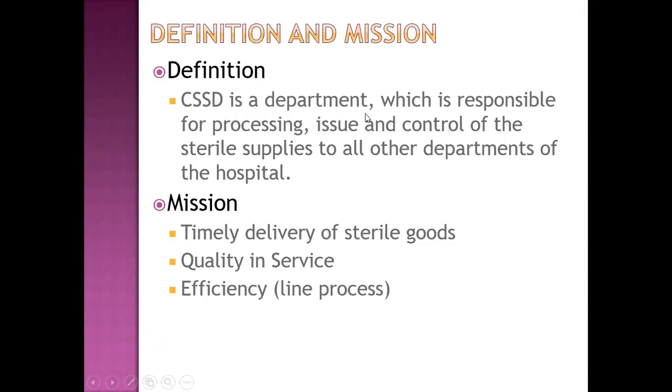CSSD is a department which is responsible for processing, issue, and control of the sterile supplies to all other departments of the hospital. Mission of CSSD is timely delivery of sterile goods, quality in service, and efficiency of line process.